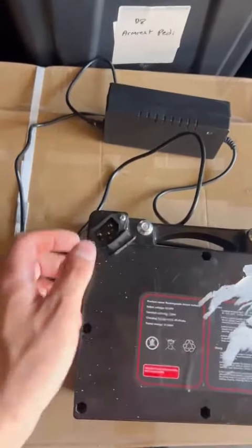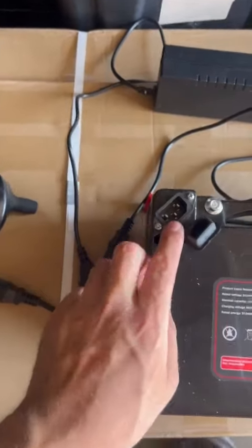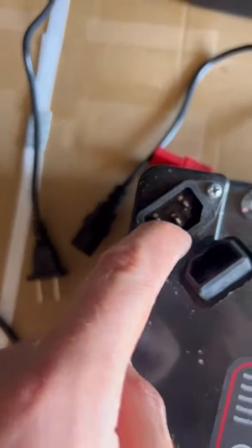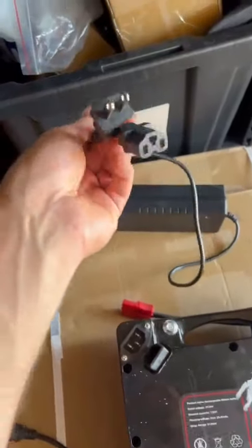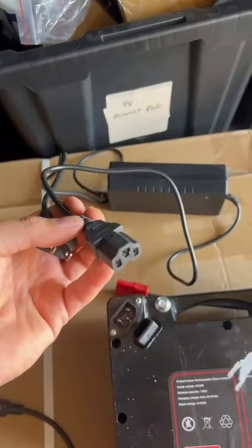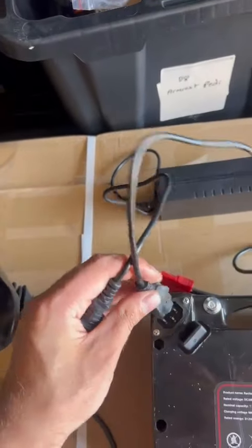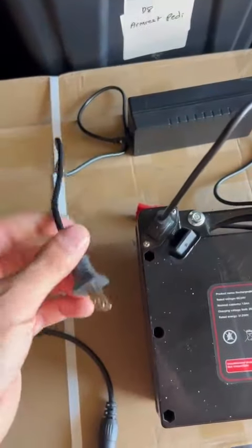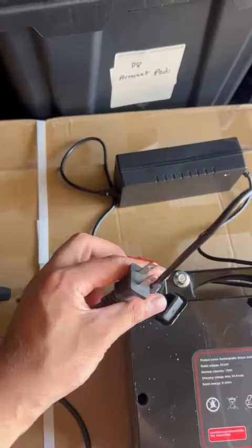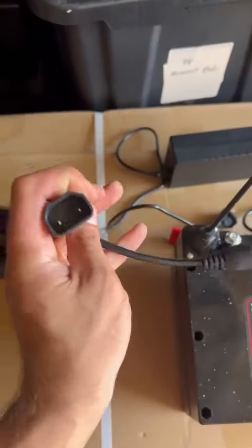This is your wheelchair's battery and this is the port. If you receive a charger like this one, it goes here to charge the battery directly — you can plug it in like this.